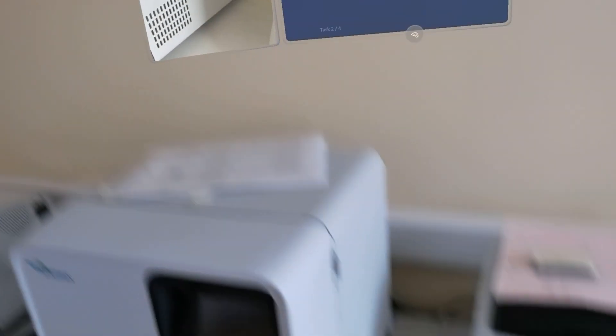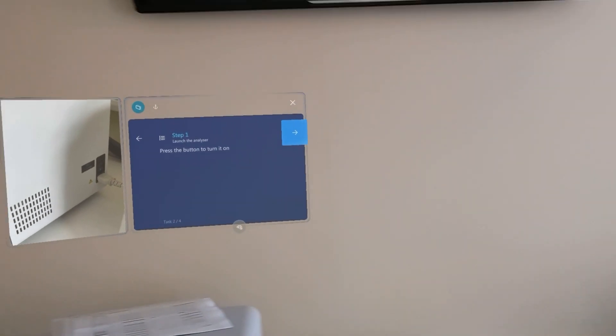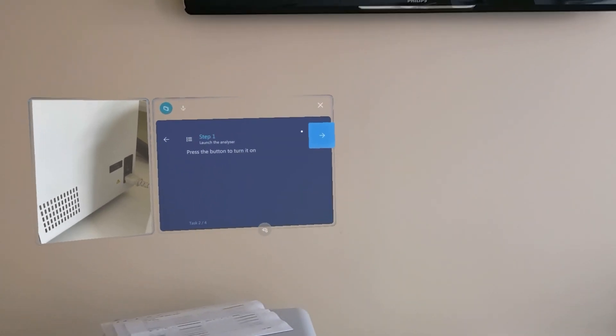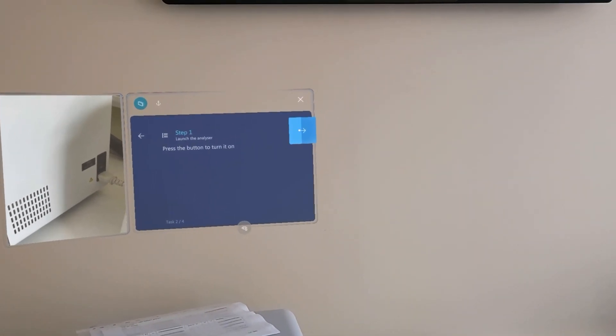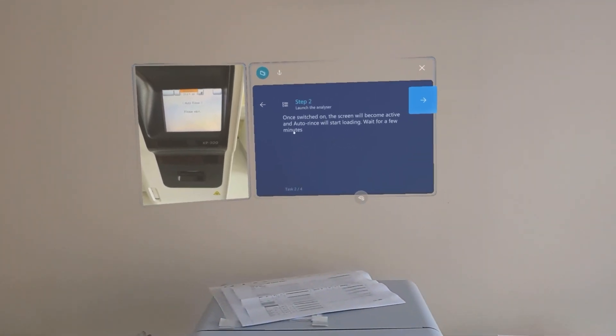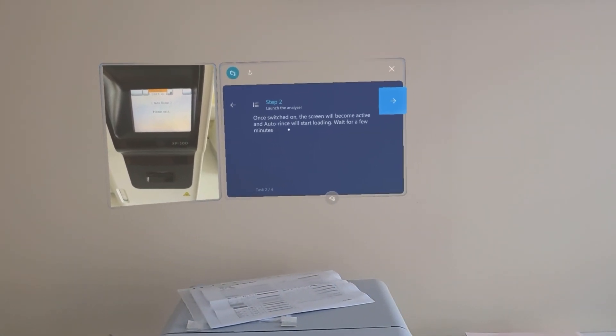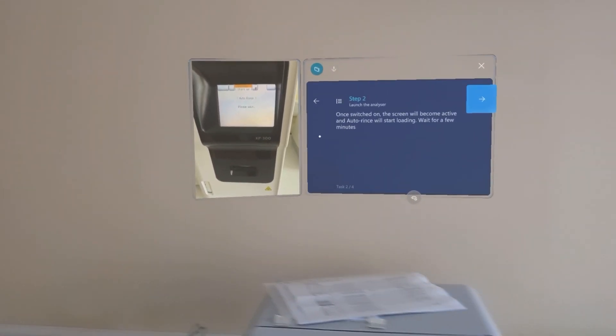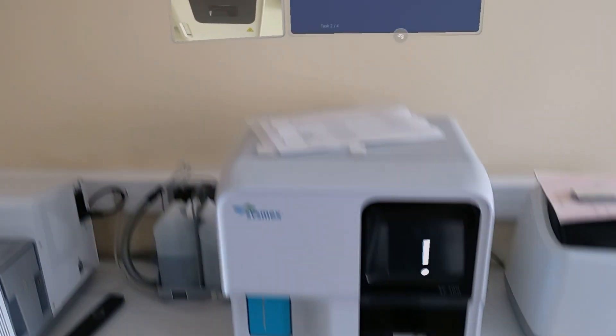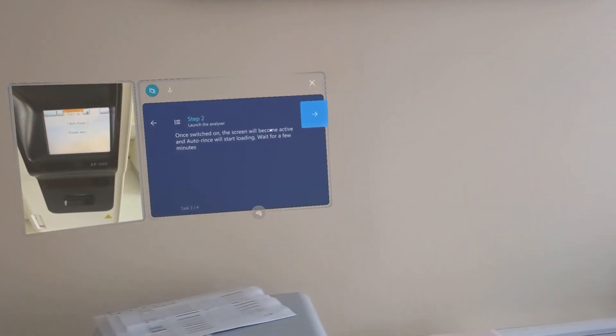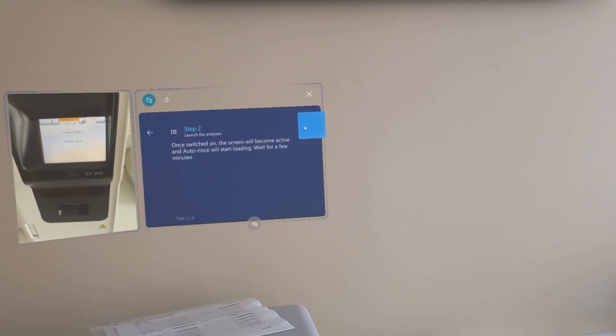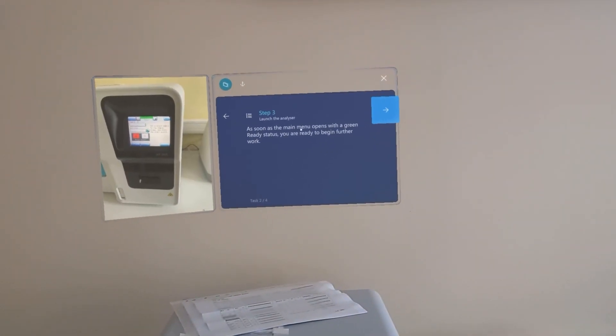To turn it on, we have a button on the right side which we need to press. When it's switched on, the screen will become active and after rinse, start loading. We need to wait for some minutes.